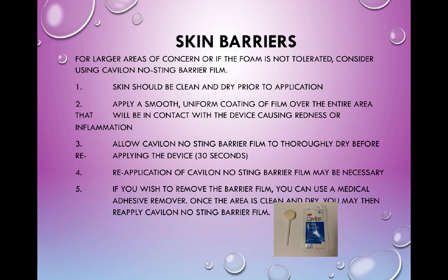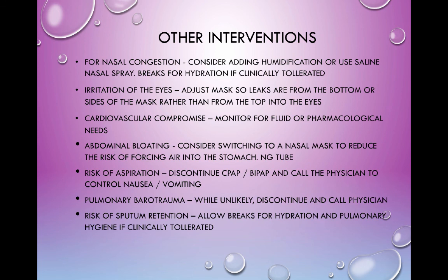Did you have to reapply it again after each use? Yeah, you know, it can't hurt. Really, to put that stuff on there, it's cheap. So I mean, we're going to wash their skin between each. If we take the mask off, we're going to wash it. So yeah, reapply.